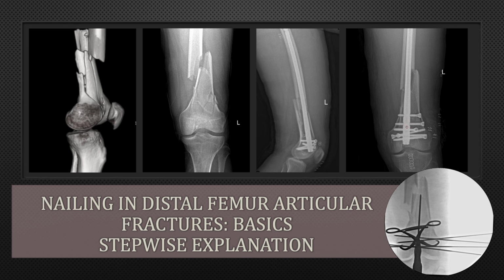So these screws are not functioning just like bolts which were used in conventional intramedullary nails. These screws are actually the part of the nail fixed angle construct. That means they do not toggle inwards or outwards or do not angulate. So kind of fixed angle construct being provided by the intramedullary nail that is actually providing more stability. First, because of the intramedullary nature of this implant, which is definitely biomechanically more stable compared to the locking plate, and also because of the screw designs that I've told.